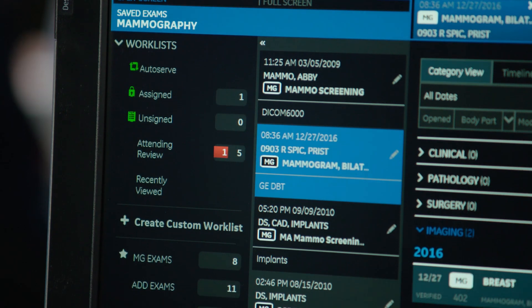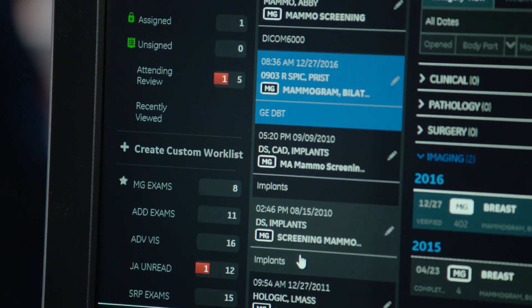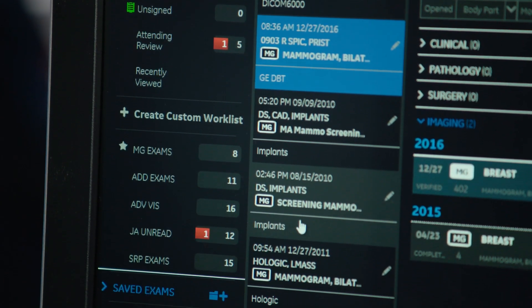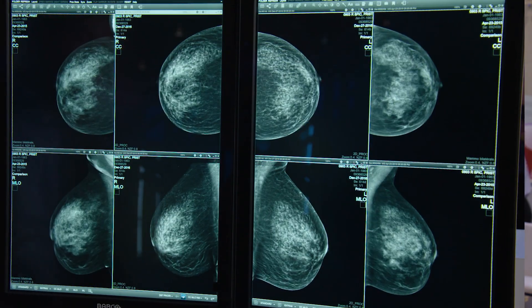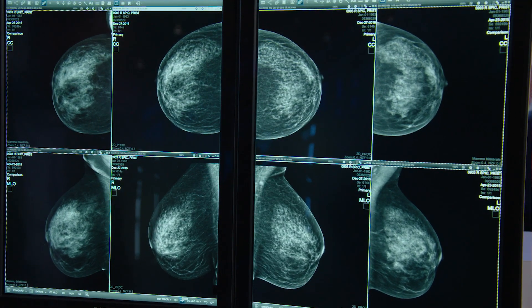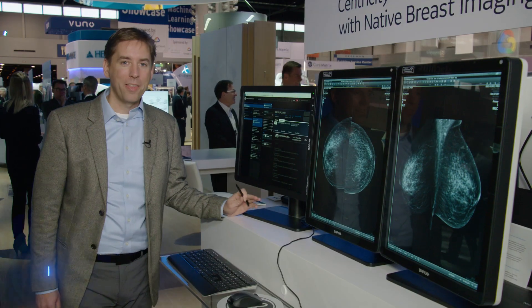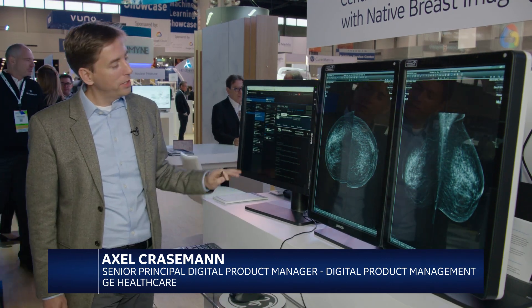The images are streamed into the workstation so there's no waiting required, and radiologists have multi-modality images available to make more sophisticated diagnostics. I'll give you a quick run through the software.